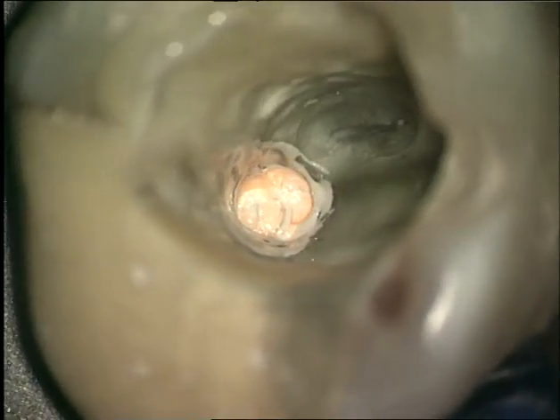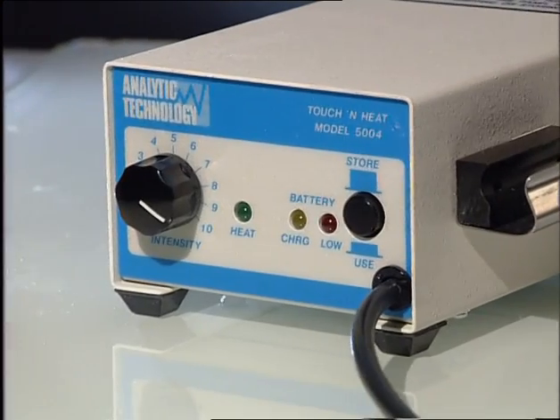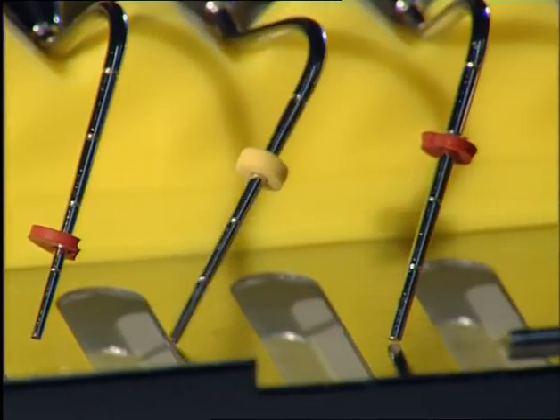The largest pre-fit plugger is used to vertically pack the thermo-softened mass apically. The objective is to capture the maximum cushion of softened material and to move it apically. The probe of the touch and heat unit is activated and allowed to plunge 3 to 4 millimeters into the coronal-most extent of the gutta-percha. The heat carrier is then removed along with an adherent bite of gutta-percha.